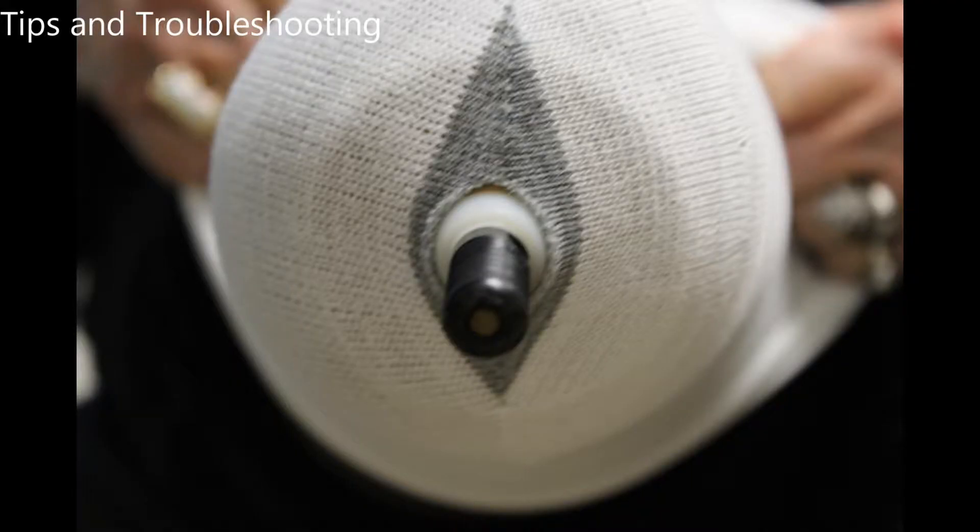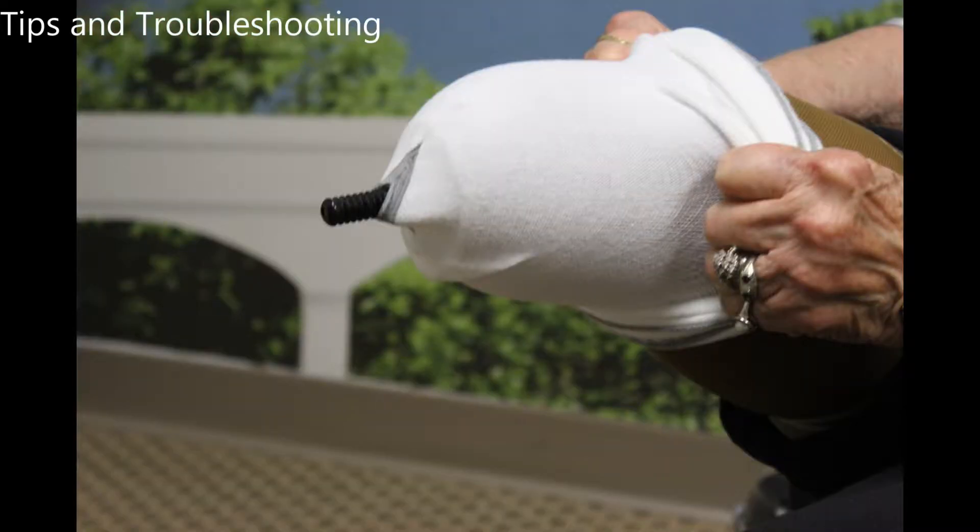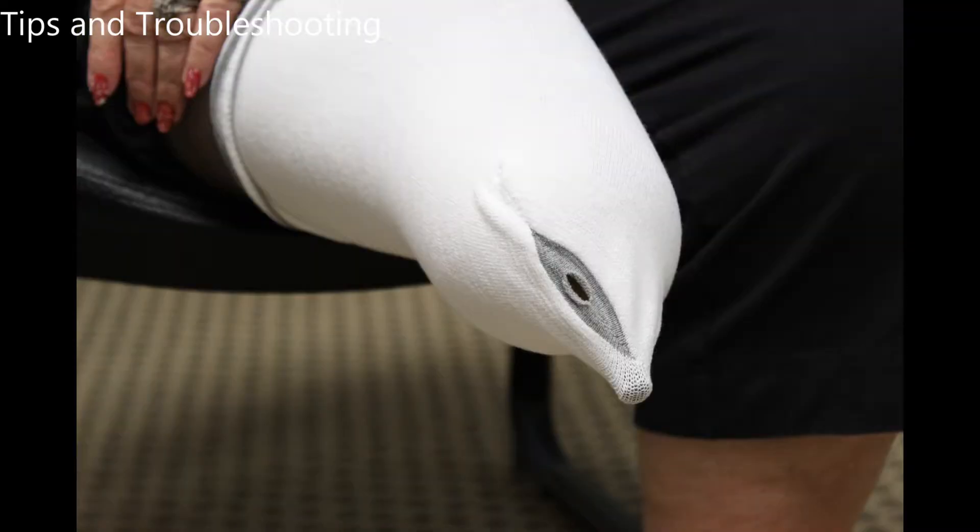When using prosthetic socks, the pin must be totally free of the sock as shown in this picture. You can feel the pin and pull the sock until you are certain the sock will not interfere with the lock. If you don't do this, as pictured here, the pin and sock will enter the lock mechanism and it is possible the system will become stuck and you will not be able to easily remove the prosthetic.